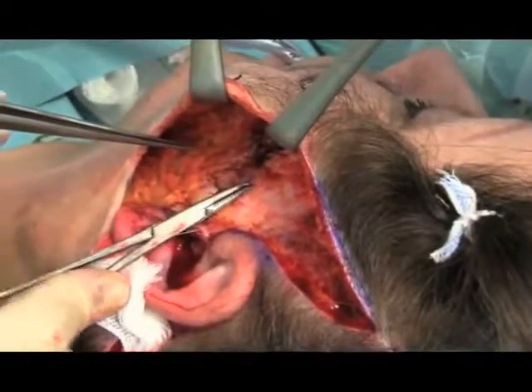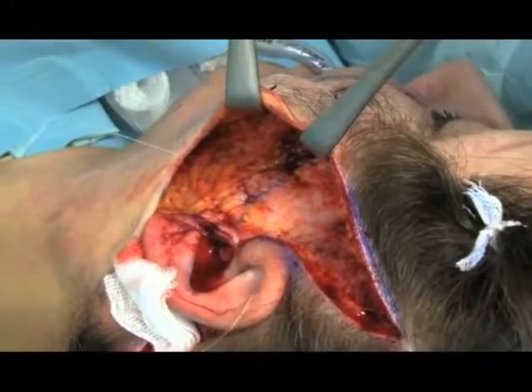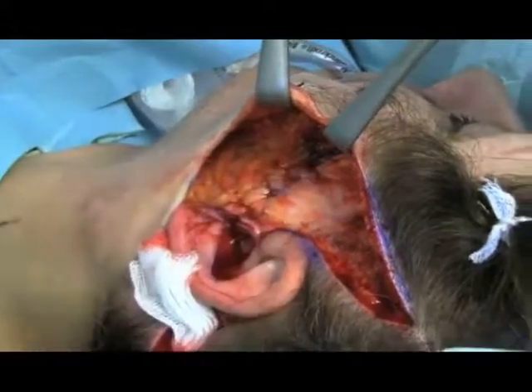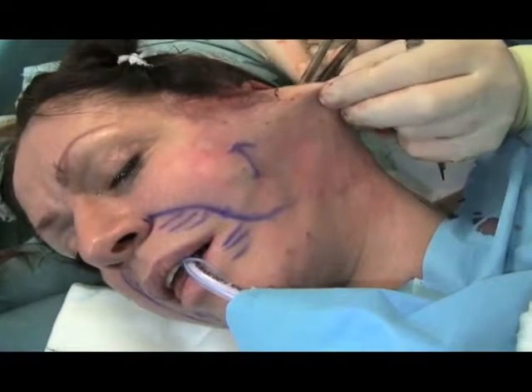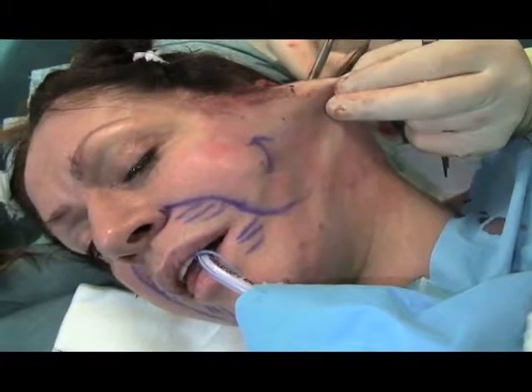For a final smooth layer, imbrication sutures using a 3-0 monocryl or vicryl may be used. Finally, the cutaneous flap is carefully checked for dimples and any tethering is addressed.